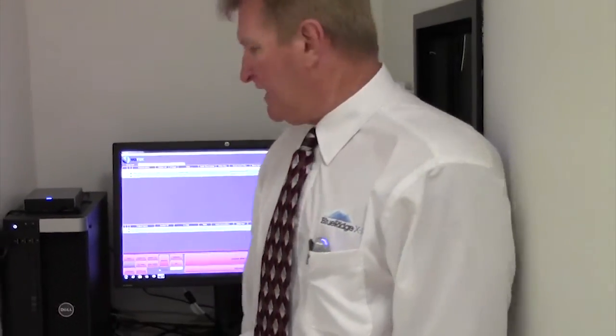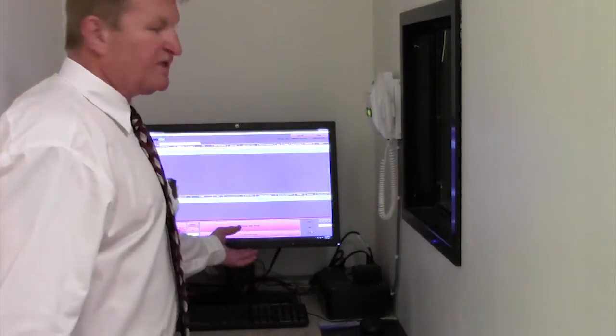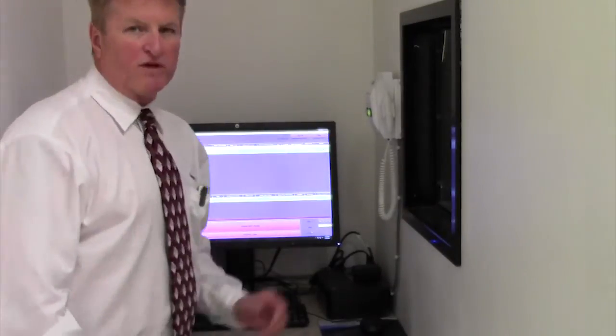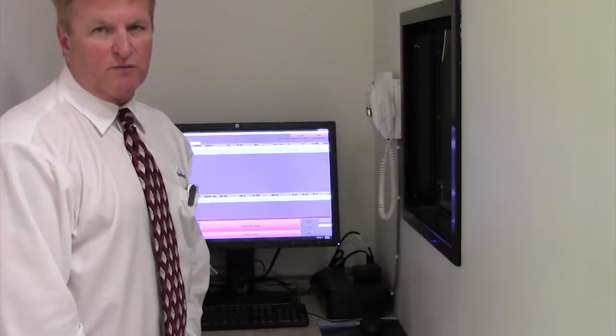The pinnacle operator station includes a Dell tower computer with redundant drives, an external drive, a 24 inch HP monitor and a 40 kW high frequency generator integrated into the software.